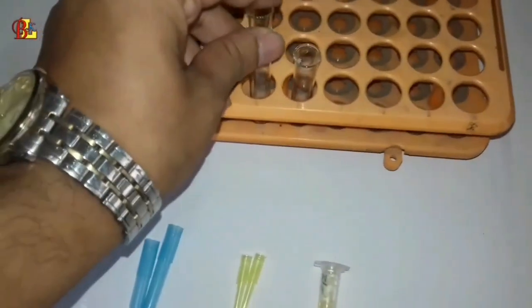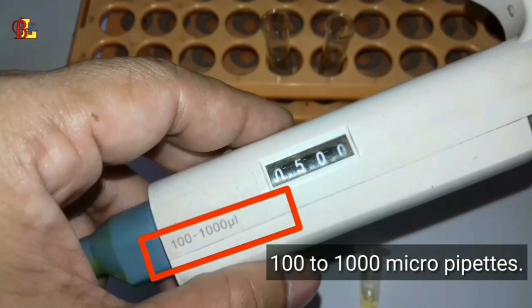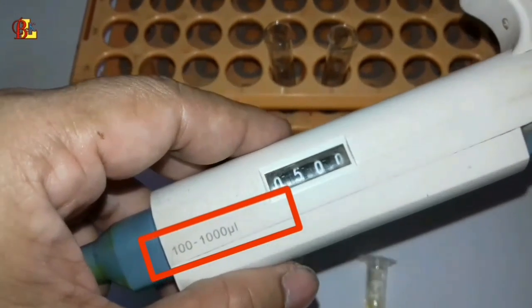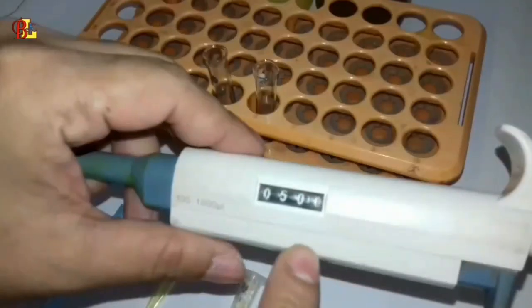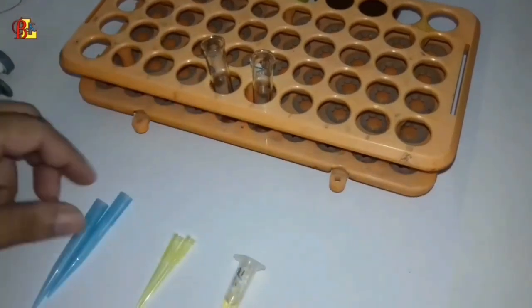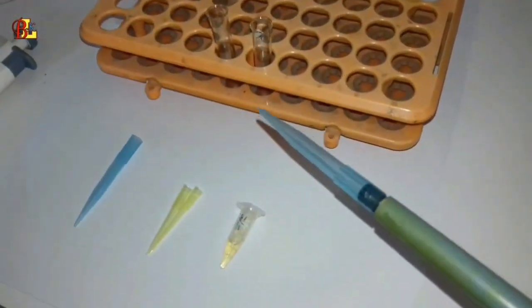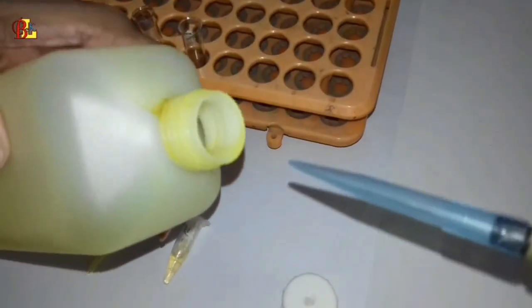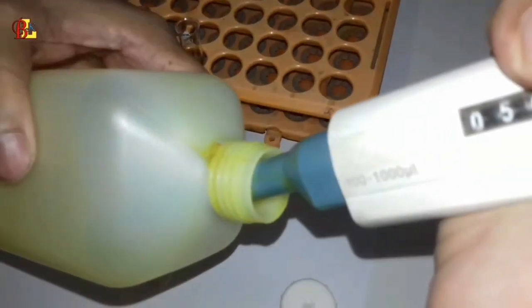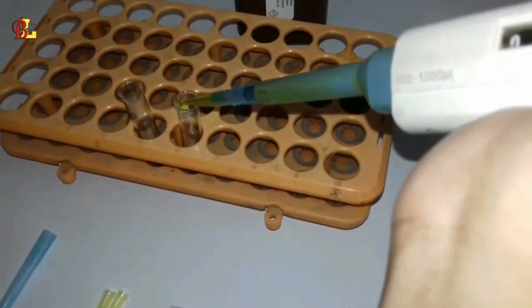Now we will take the reagents into a test tube using a micro pipette. The micro pipette in my hand is a 100 to 1000 micro pipette. With this pipette, 500 microlitres of both reagent R1A and R1B should be taken into a test tube.